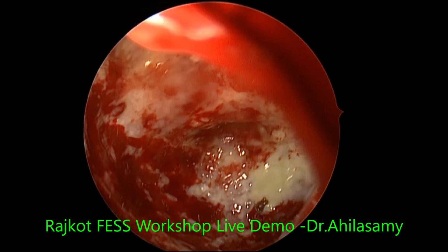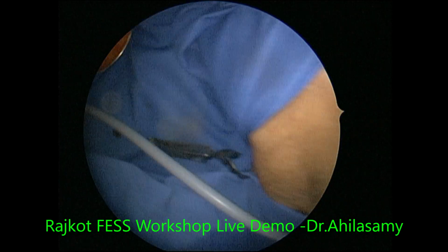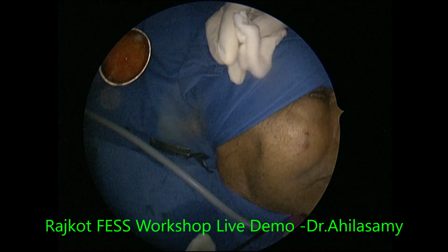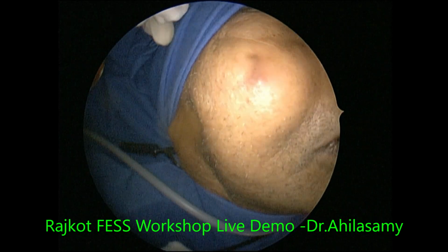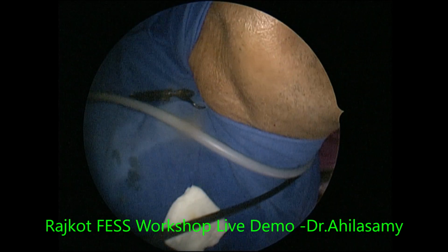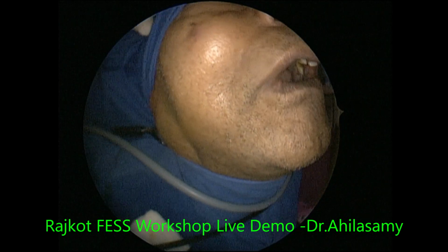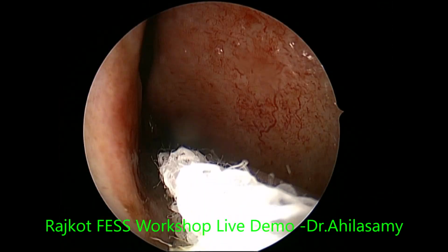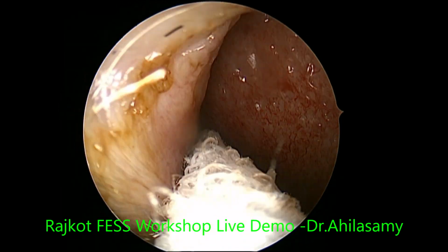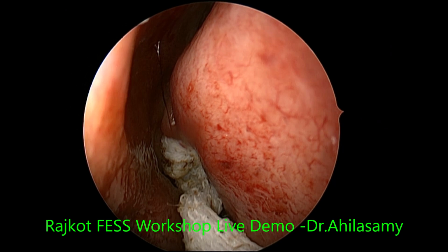So I applied everything. I can't wash, but I will show the wet mopping technique. I will mop it up. In the olden days we washed the floor with water. Now people are living in apartments and can't wash the floor. So this is Ahilasamy's technique of wet mopping. We mop the floor nowadays. Now that has also gone, and people are using vacuum cleaners. So many things on the name of Ahilasamy.